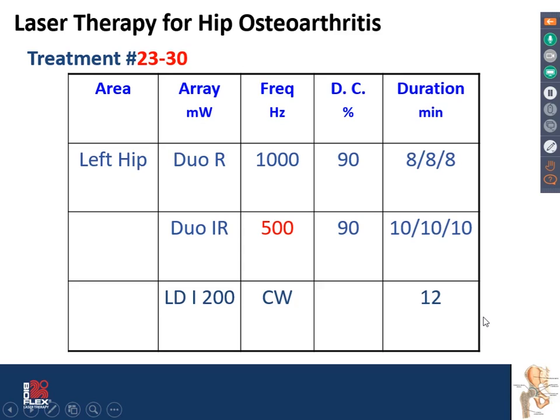Oh, sorry. There are treatments 23 to 30, and you can see we modulate the infrared as well up to 500. So she had quite a few sessions with us.